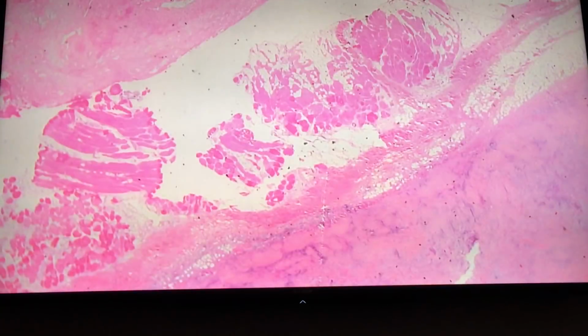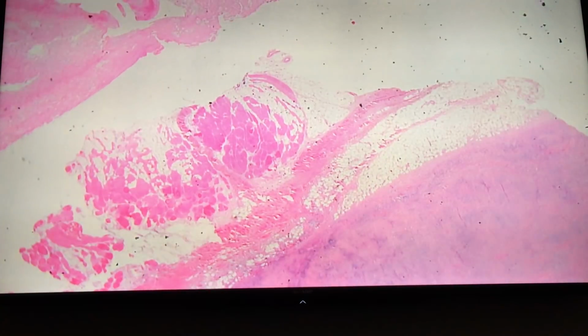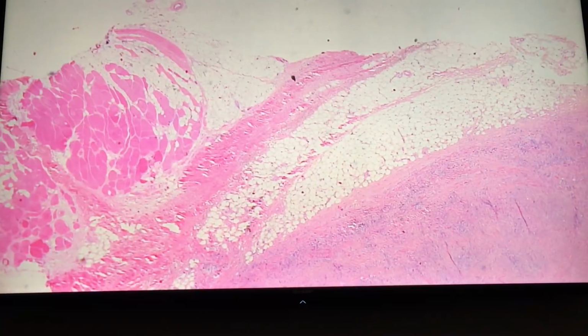Aaron, show them the normal tissue. Muscle. Yes, exactly right. Muscle. You've got some fat right down there. Yeah. And so we are probably in the chest wall and pleura. In fact, if you're on the chest wall side of the pleura, you're probably in parietal pleura, right?